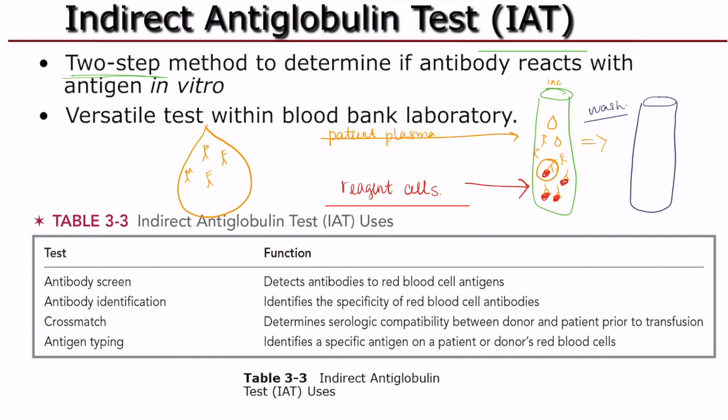So we're going to wash them. And what we're going to have left over here, I'll draw my antibodies first. Okay, that's what we have left after washing. All of these guys here have washed and gone down the drain. Down the sewer system. Essentially, that's where they've gone.